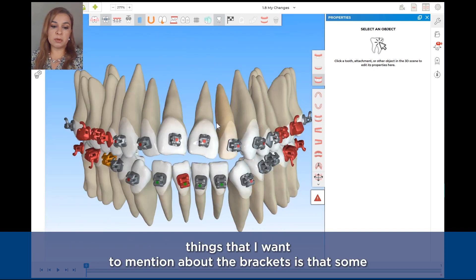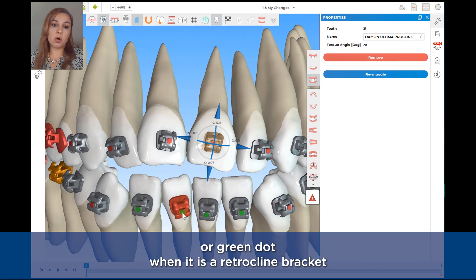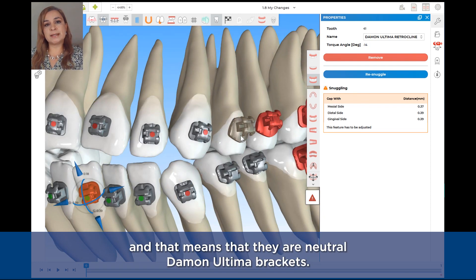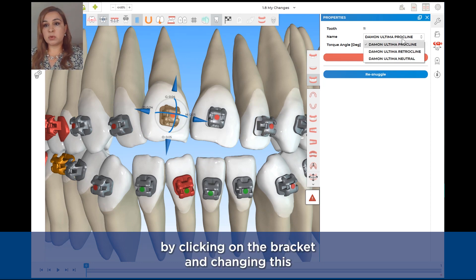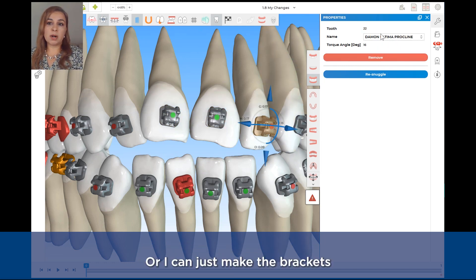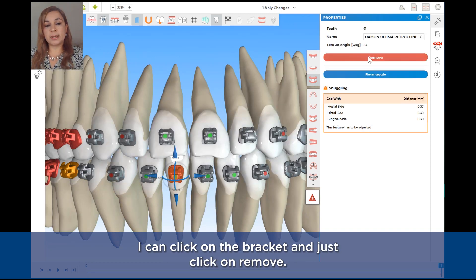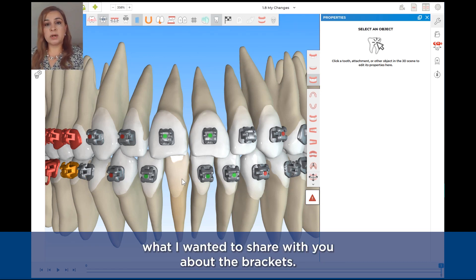A few more things about the brackets: sometimes you will see brackets have a red dot when it is a Procline bracket, or a green dot when it is a Retrocline bracket, or some brackets may not have a dot at all, meaning they are neutral Daemon Ultima brackets. You can edit this in the prescription by clicking on the bracket and changing it — I can change a Procline bracket to a Retrocline bracket or make it neutral. In some instances, if I decide that I want to extract a tooth to resolve crowding, I can click on a bracket and click Remove, and this bracket will be removed from that tooth.